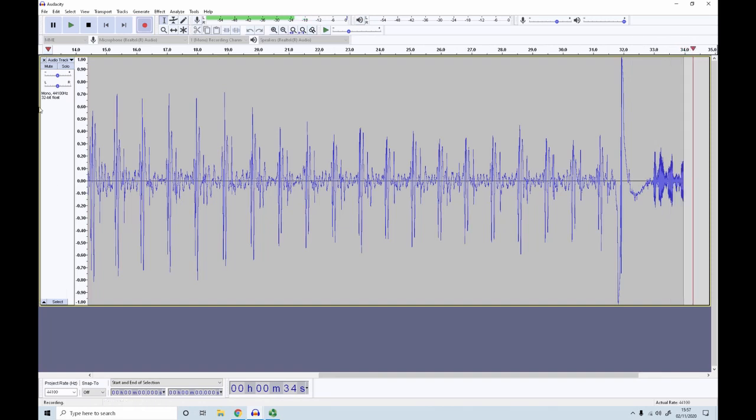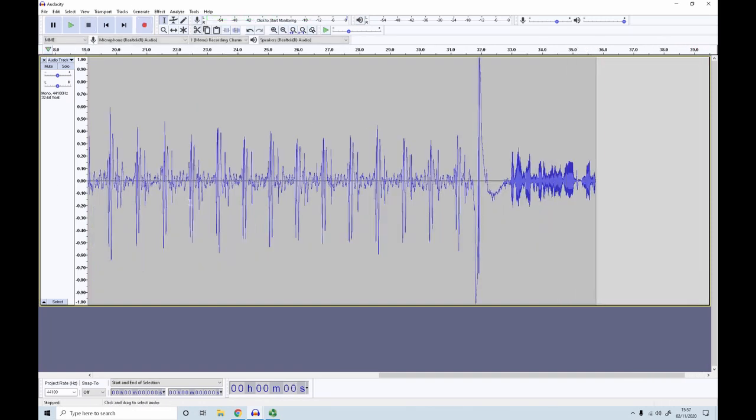Okay, so what you can actually see are multiple waveforms that are repeating here. Each of these large waves here is one heartbeat, and in fact in that heartbeat there are multiple sounds. There's a large rapid set of oscillations first, then another peak that's slightly smaller and simpler, and then a third peak, and you can see that repeats each time.